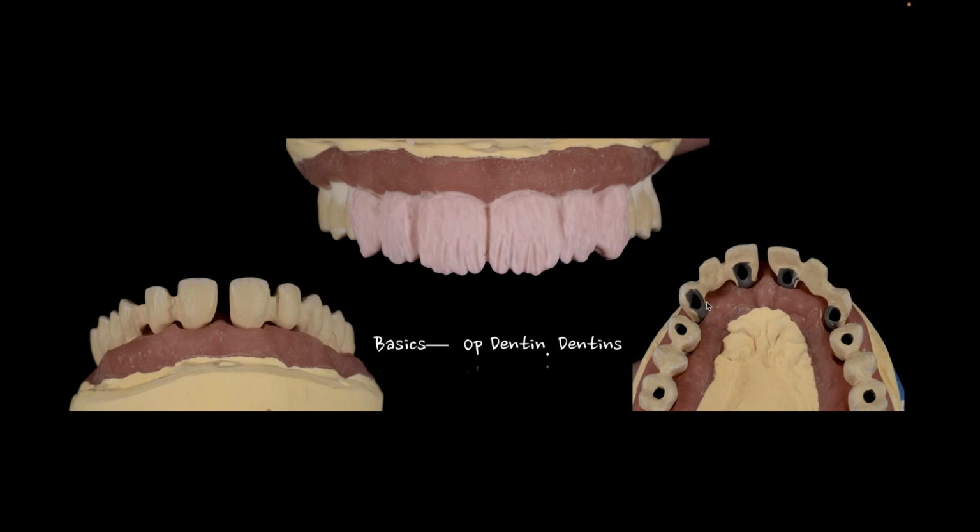So a basic dentin buildup here, and you can see in my dentin buildup, I'm already starting to create what I want my incisal edge to be. You'll notice that my incisal edge at this point is kind of straight across. I'm not really making a lot of up and down. Why? Because the end result for me with this case is not going to be a ton of translucency or a ton of mamelon and translucency next to it. It's going to be a little bit more of a monochromatic incisal edge for this patient.